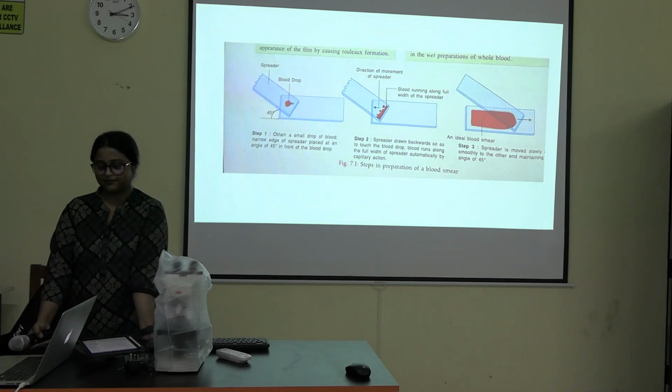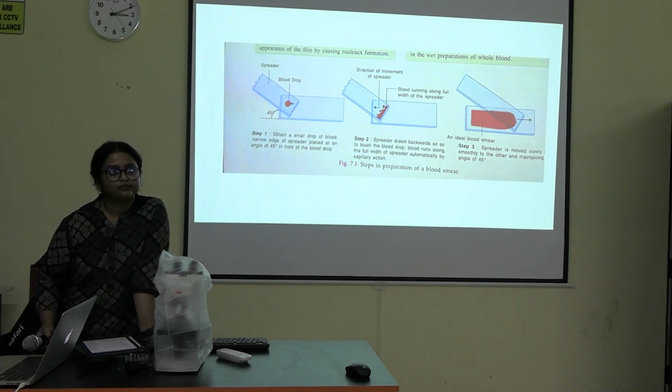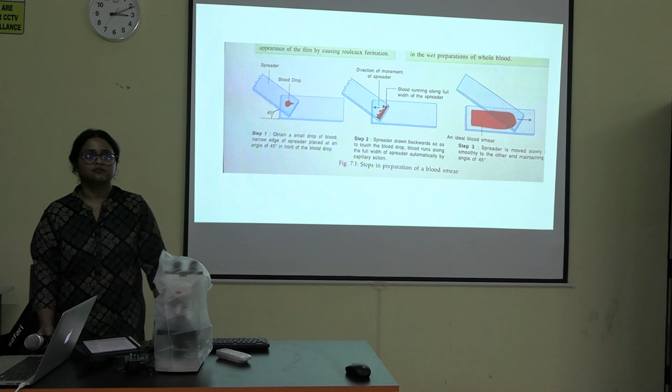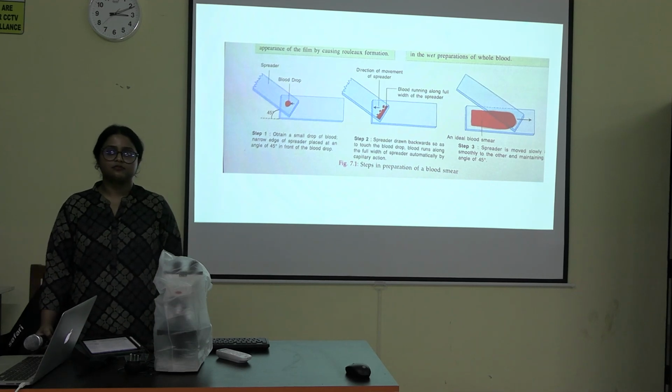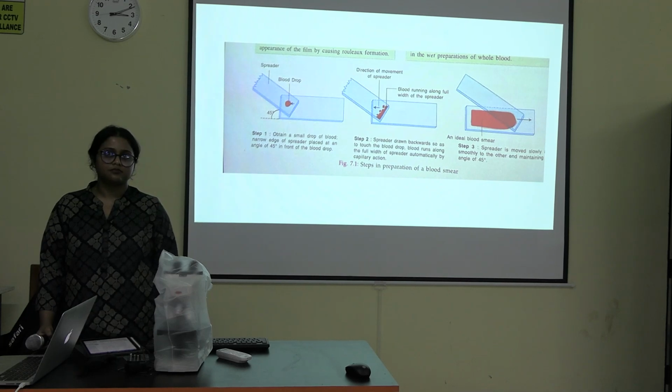So they will take the acidic dye, means they will take eosin. They can be colored by the eosin. In the cytoplasm, some of the cytoplasmic granules take the acidic stain, some take the basic stain, and some granules of some cells take both stains, means they are neutral.